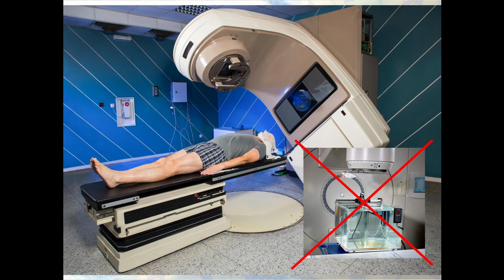Okay, now we've talked about calibration and we want to irradiate a real, genuine patient. And when you do that, you cannot control, using a water tank and an ionization chamber, whether the delivered dose is correct or not. You have to use another device such that the patient will receive the proper treatment, which you cannot control with a water tank and an ionization chamber. So how do you do that?